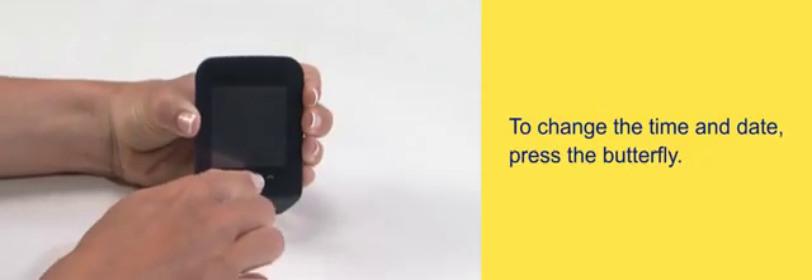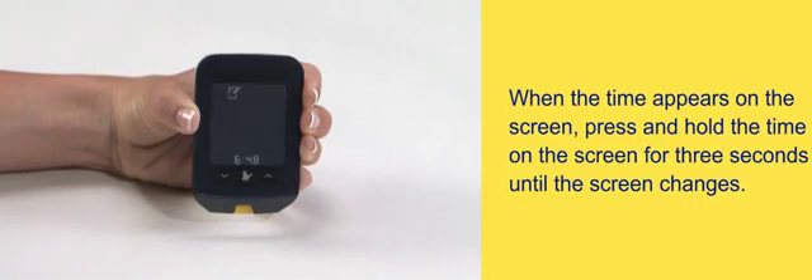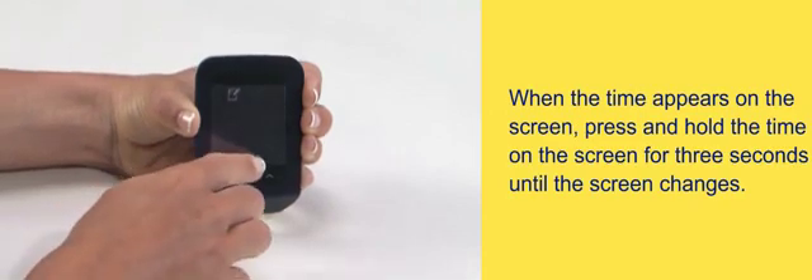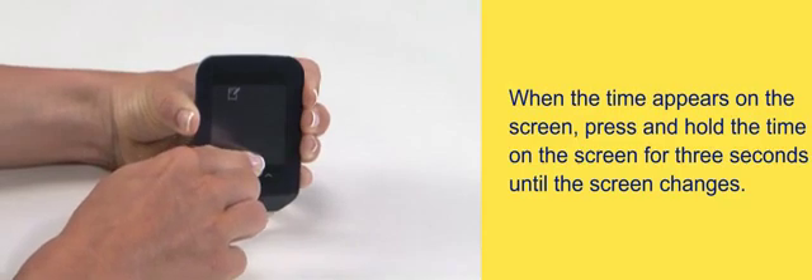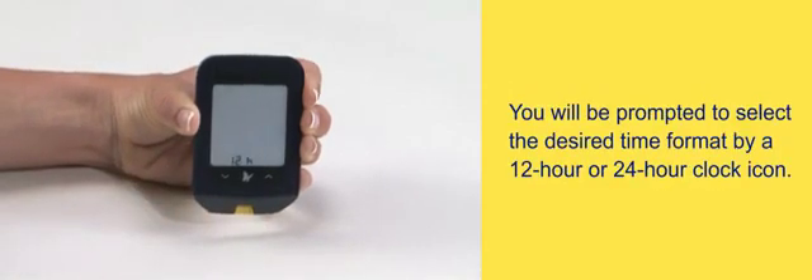To change the time and date, press the butterfly when the time appears on the screen. Press and hold the time on the screen for three seconds until the screen changes. You will be prompted to select the desired time format.